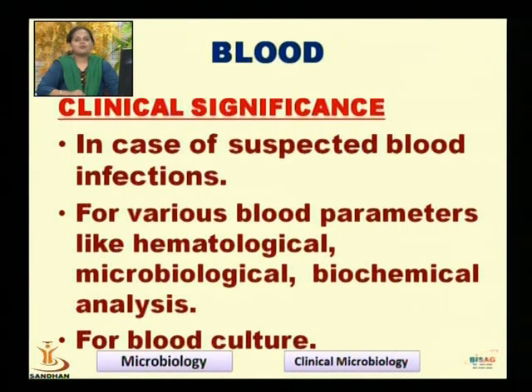Other than that, there are a variety of blood parameters that can be studied, like hematological parameters, microbiological parameters, and biochemical analysis parameters. Another thing is to study the different microorganisms growing inside the blood, that is the blood culture technique.